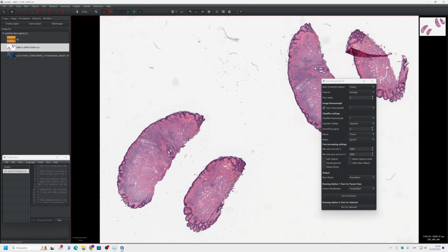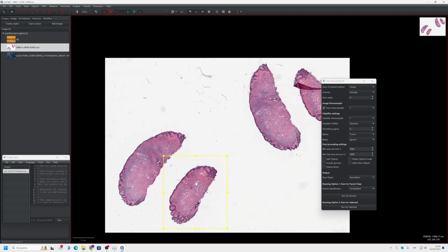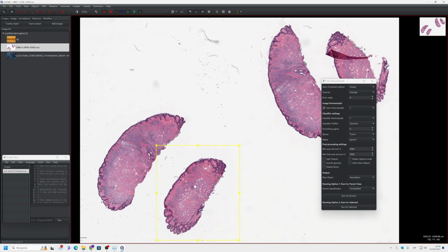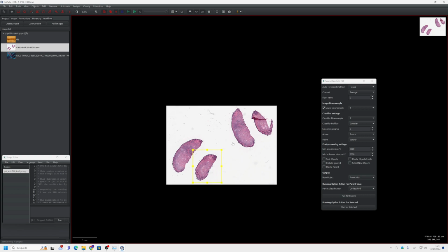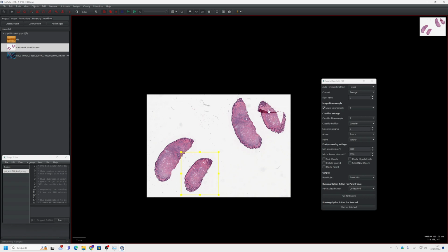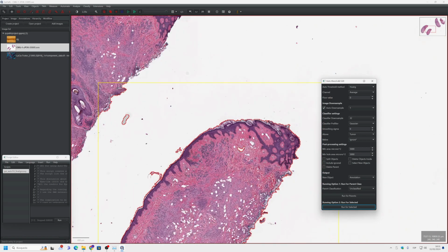When applying these auto-threshold methods, the region of interest is sent to ImageJ to compute this threshold, and then you apply the classifier. The user can choose this downsample manually, but if not, it is going to take the downsample of your current viewer. I got this inspiration from the Segment Anything extension, and let's check how it works. And here is the classifier. I'm going to put it at low resolution. So here we have our segmentation.